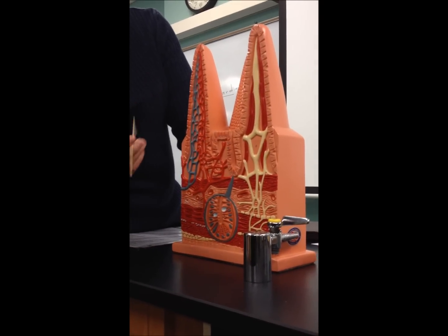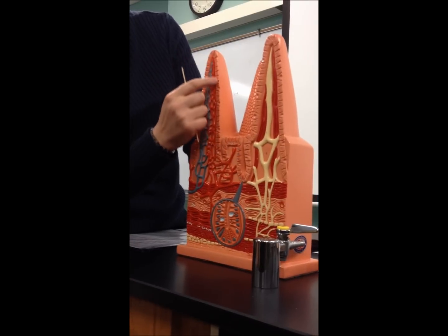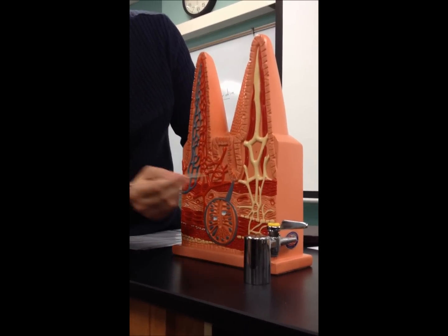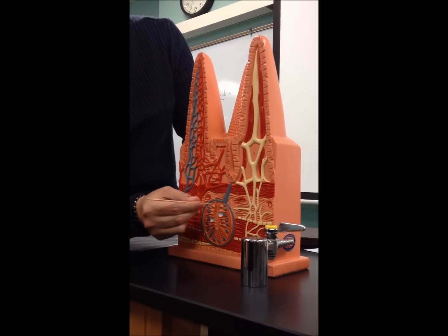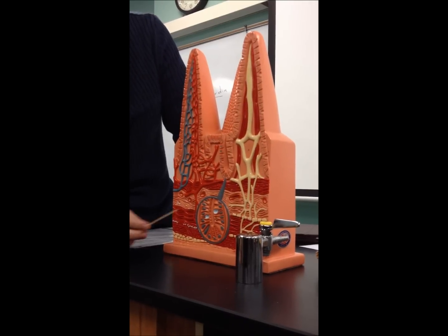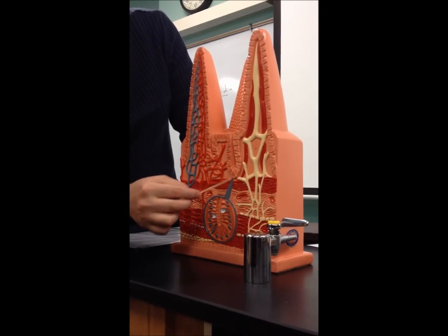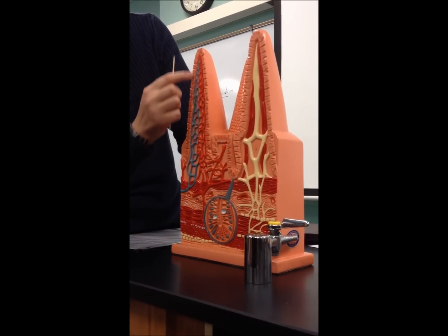The mucosa has the epithelial tissue. All these epithelial cells do secretion and absorption, and you're going to have some goblet cells. It's enlarged here to make it bigger, demonstrating the goblet cell in a bigger image. So inside the epithelial cells, you're going to have some goblet cells. This is the epithelial layer.